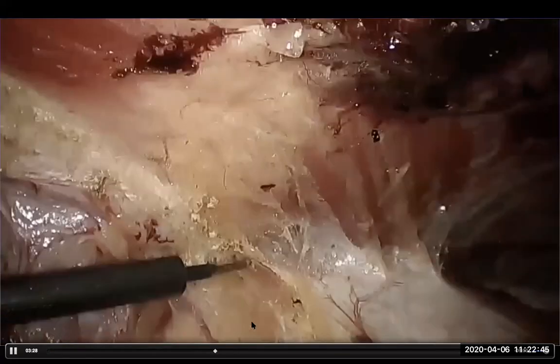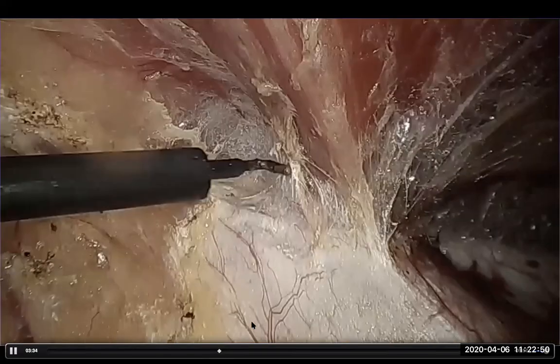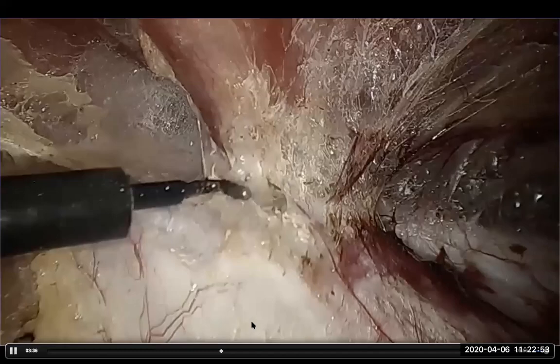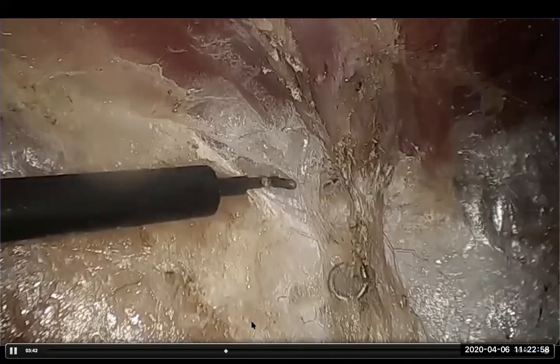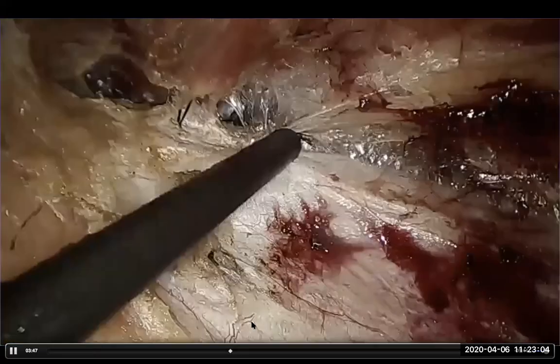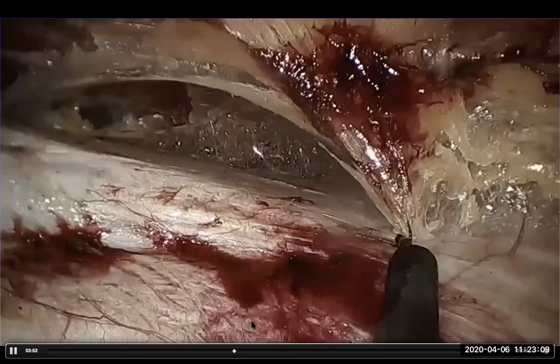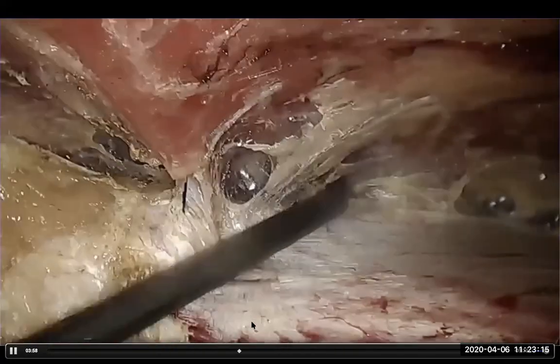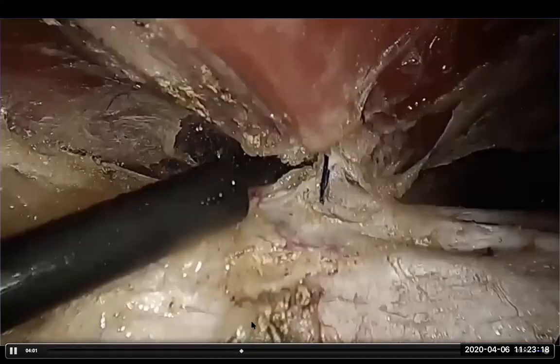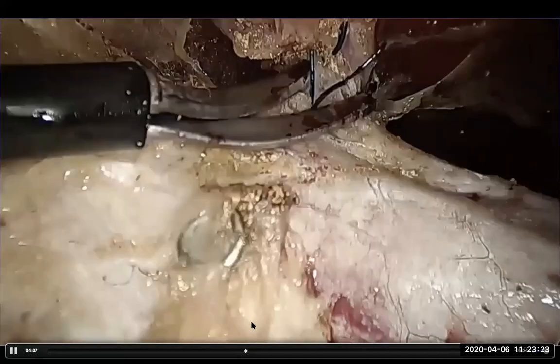You can see that now. That's the central hernia defect with the sac coming. Now you see the tack. You can see that. So that was the tack. It hardly ever crosses the posterior rectus sheath, and it is not usually a problem to do a post-IPOM recurrence through eTEP access. As I said yesterday, I've even done cases where laparotomy wounds have been closed with stainless steel wires, and we have not had problems in removing those stainless steel wires through eTEP access. Now, these are the transfascial sutures, and we are dividing them.